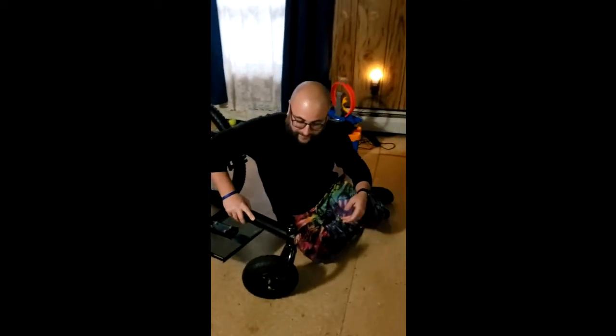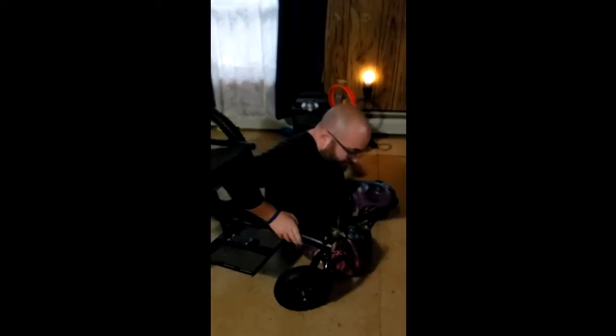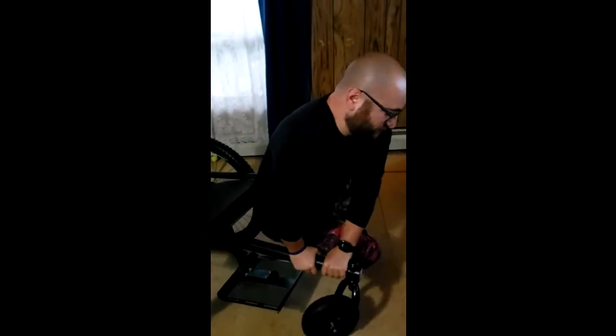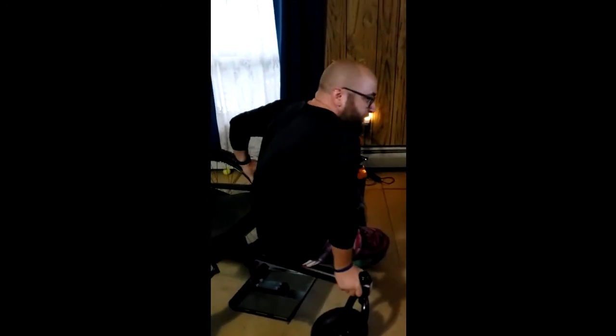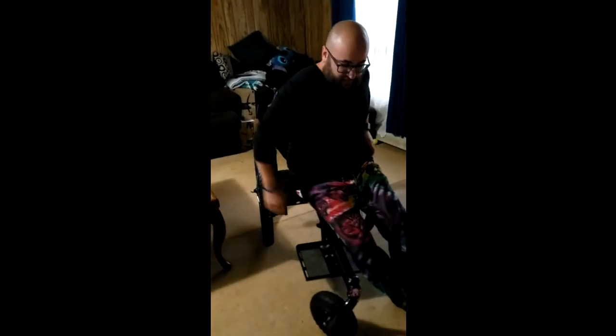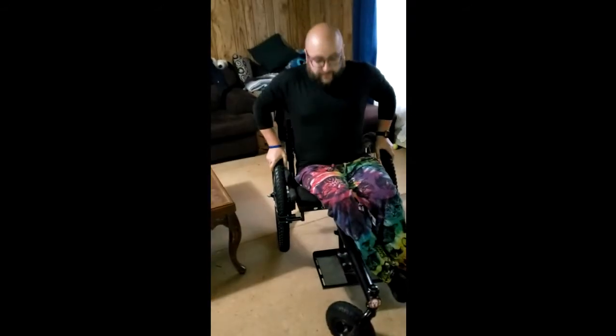To get back up, I get as close as I can, press on the boom, kind of place myself a little bit on the boom here, get my hands on the boom and tire, and then press up in, and then slide back.